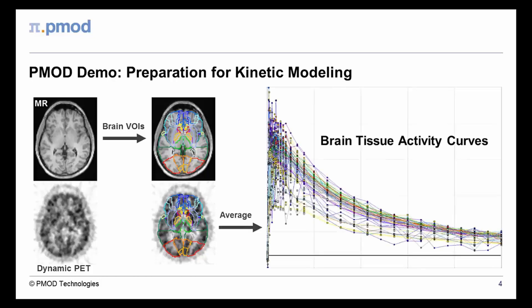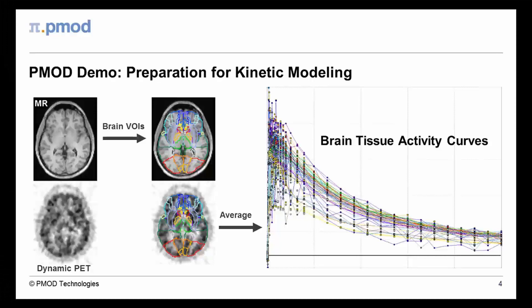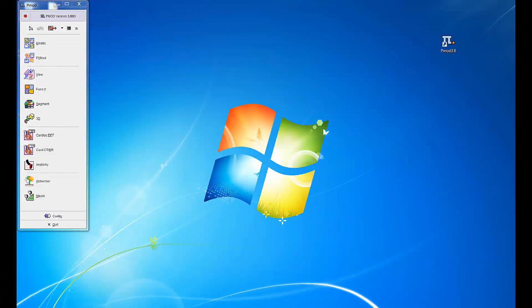Finally, the resulting time activity curves are directly transferred to the kinetic modeling tool, illustrating the seamless integration within the PMOD environment.